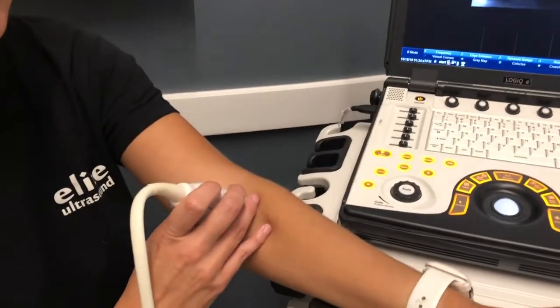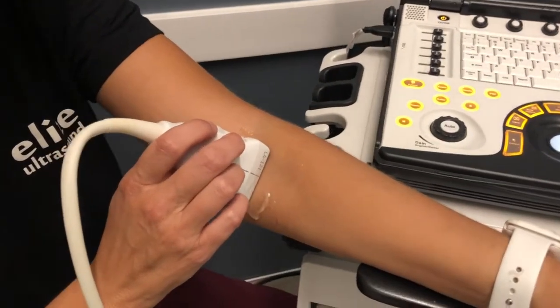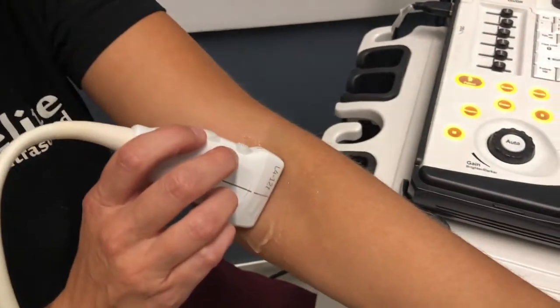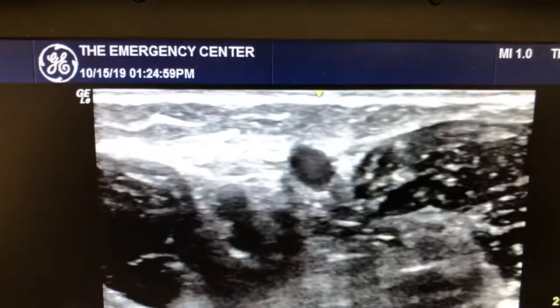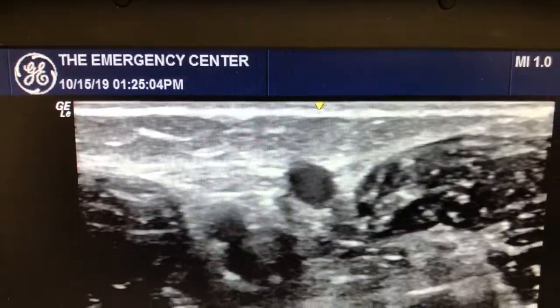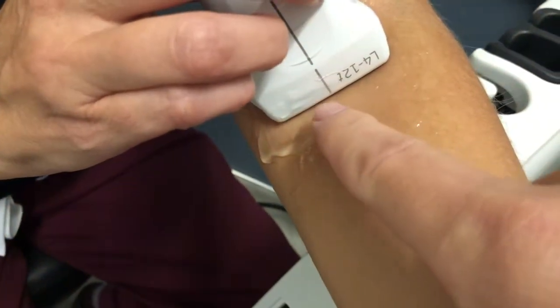Yes, of course. So what I would do is hold the probe in your left hand, and if you line up that vein right underneath that yellow triangle, then you can insert the needle right in the middle of this probe, right where that line is.